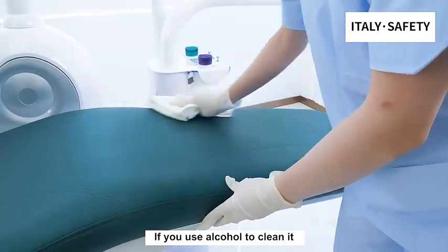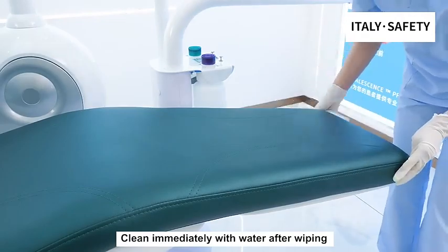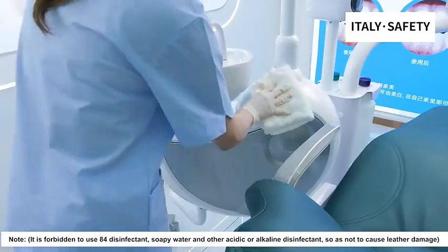If you use alcohol to clean it, clean immediately with water after wiping. It is forbidden to use 84 disinfectant, soapy water, and other acidic or alkaline disinfectants, so as not to cause leather damage.